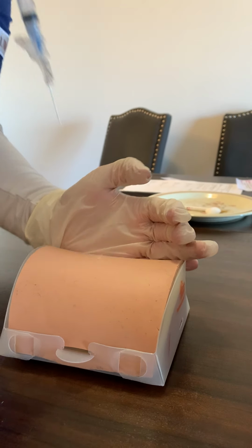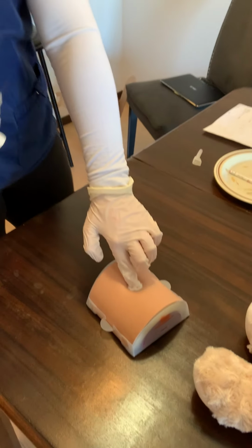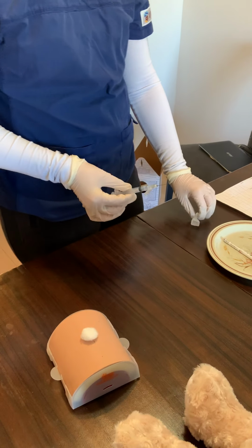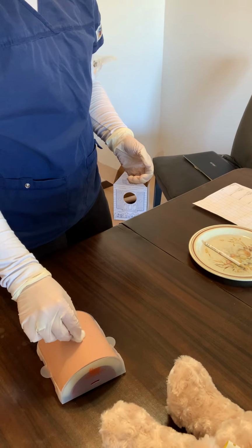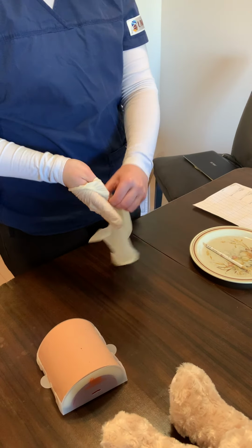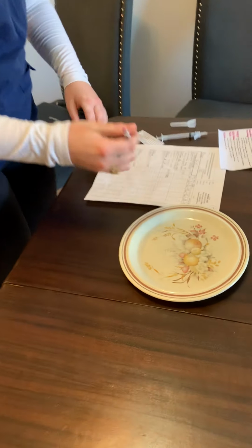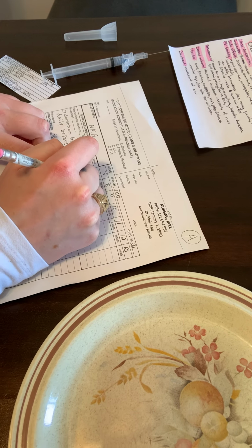Okay, I'll remove the needle. I'll let go of the Z-track and put a cotton puff here for 30 seconds. I'll tell them to hold it. I will activate the safety mechanism and throw it in the sharps container, but for now I'll just place it over here for the demonstration. So 30 seconds is up, and I'll take that and throw it in the garbage. I'll take my gloves off, wash my hands, and sign the MAR.